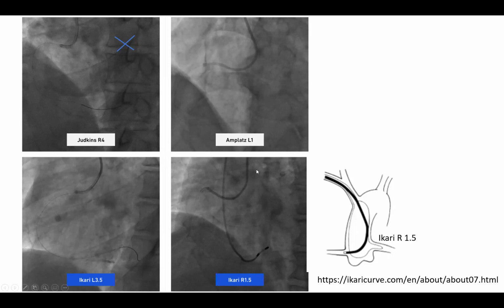So you have to react to how your catheter is shaping. A lot of time, clock gets your catheter in, counterclock gets it out. Like when you're doing ostial stenting, you clock to get in, you counterclock to disengage and put your stent in.